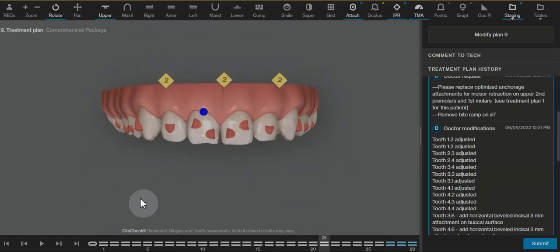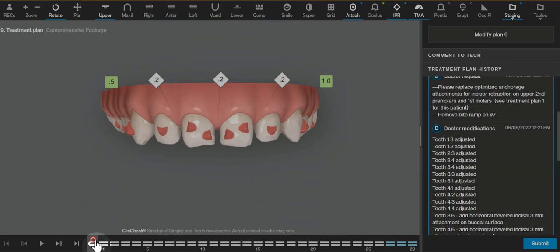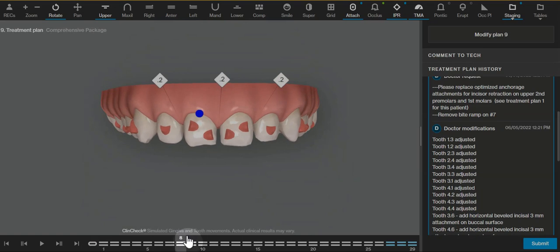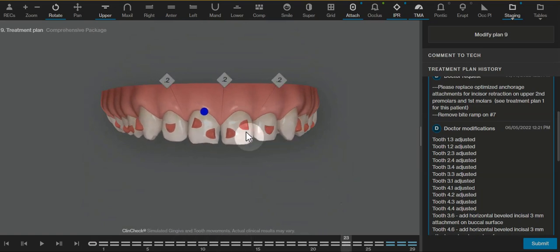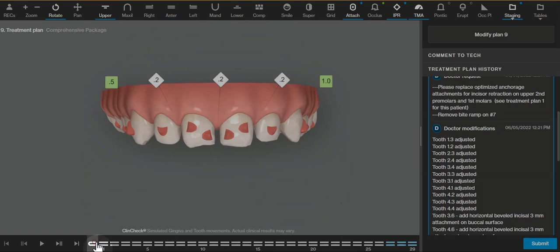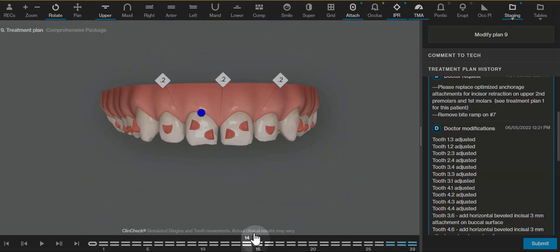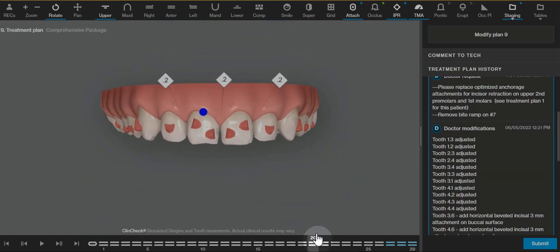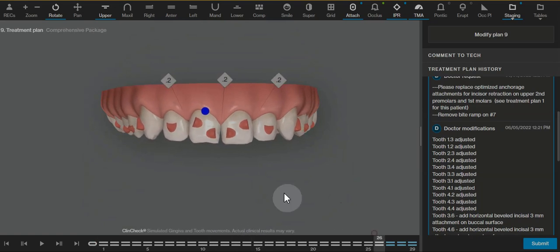I always want to have optimized lateral support attachments on a spacing case because very rarely do I need to do extrusion. And then these attachments are meant to help guide these roots to come together so that these teeth are more vertical with each other at the end, and they even over-treated this slightly.